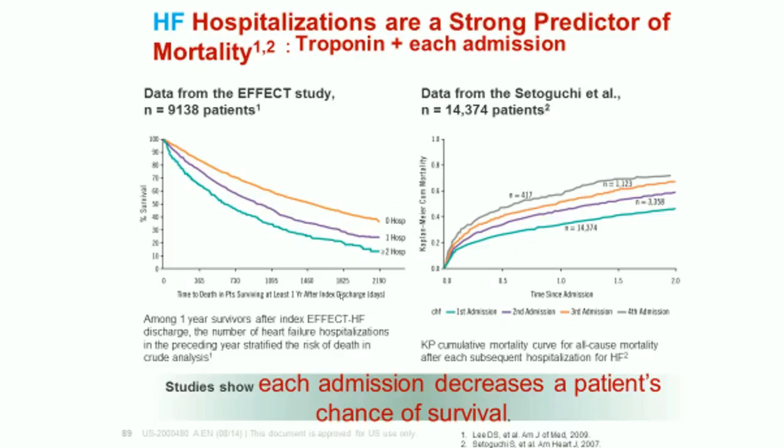And of course, if we look at those CardioMEMS recorders, recording the pulmonary artery pressure and transmitting it, you will find that you can predict the hospitalization for congestive heart failure 30 days before it happens. 30 days before you can detect volume changes, pedal edema, increased shortness of breath. 30 days before, you can see the pulmonary artery pressure is drifting up, and that wasn't from eating a bag of potato chips the day before admission. And so we're all wrong about that. I've seen that happen so many times, and you can't do that. That's not a cognitive approach to the problem we're addressing.